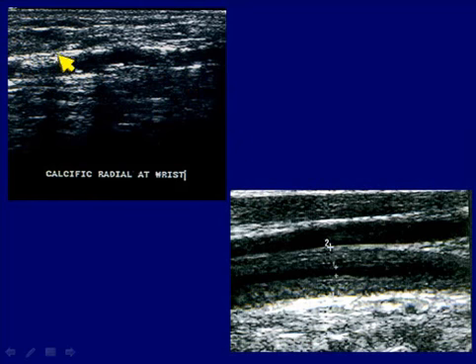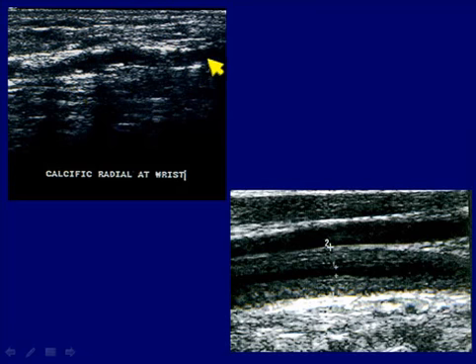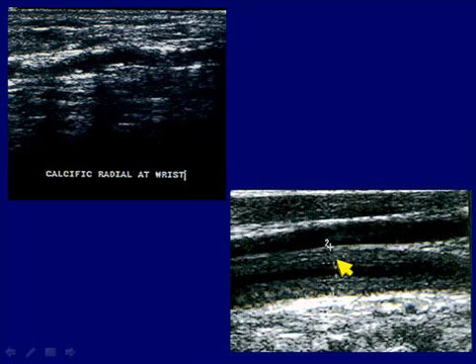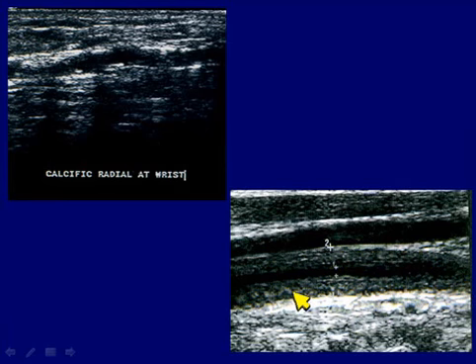Here's a radial artery in the forearm with intermittent calcification. Sometimes it's hard to tell if it's borderline for use. Obviously if we see extensive calcification, that vessel is not suitable as a conduit. But with this small intermittent calcification, if you can compress the artery closed with the weight of the ultrasound transducer, we probably still have enough compliance that the vessel would be suitable if no other conduit is available. In another example, this diseased artery shows uniform thickening to the vessel wall — not like plaque at all — very common in patients with arteritis.